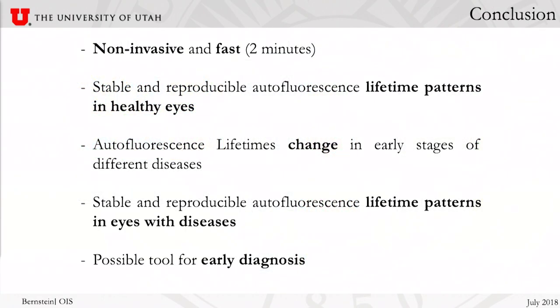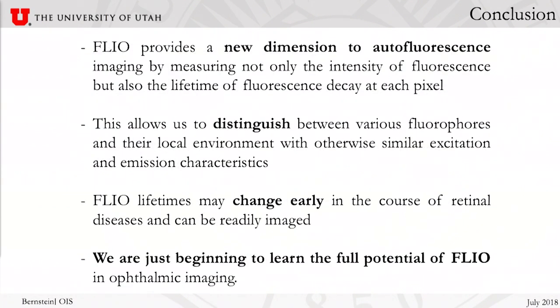So in conclusion, FLIO is non-invasive and fast. It takes just 2 minutes. It is stable and reproducible and shows lifetime patterns in healthy eyes. These seem to change in early stages of different diseases, and these lifetime patterns are associated with disease and may be possible for early diagnosis. It provides a new dimension in autofluorescence imaging that allows us to distinguish between various fluorophores that change early in disease. And we're just now beginning to see the full potential of FLIO in ophthalmic imaging.